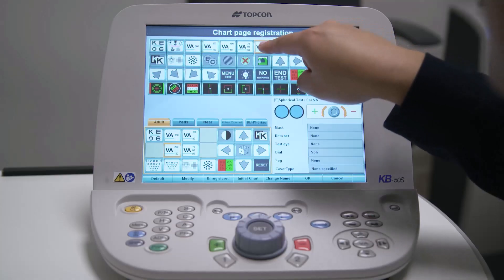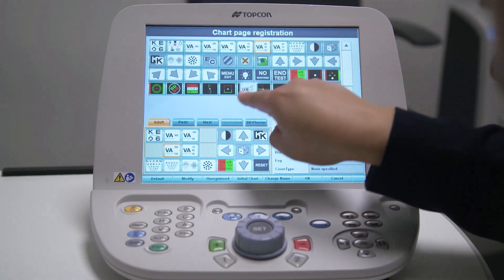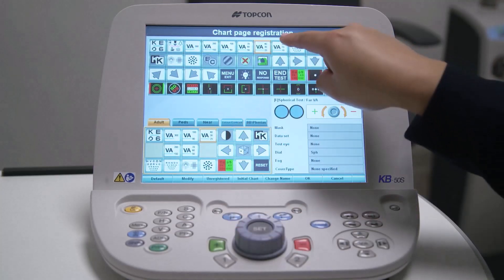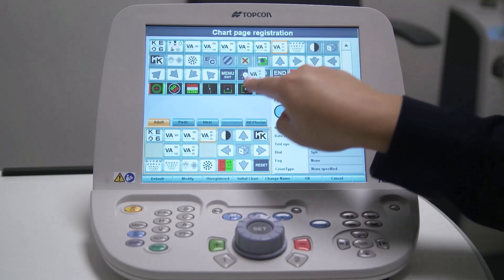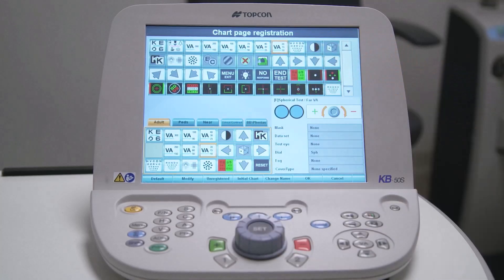Now that you have freed up some room, you can move any chart icon from the list of icons at the top of the screen into any free slot on the chart page. Just touch, drag and drop the chart into the desired slot. Repeat this process, adding your preferred charts to the other chart pages. For example, you might want a particular selection of charts for testing children.